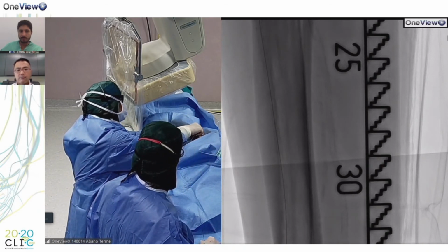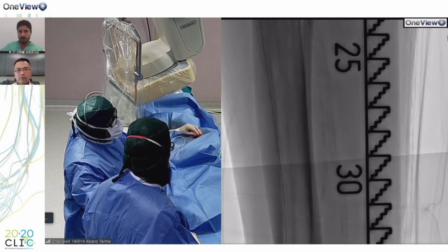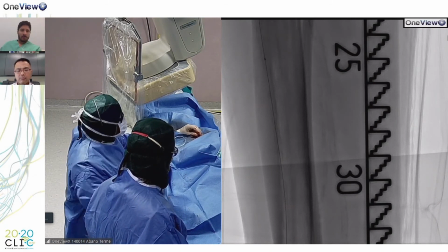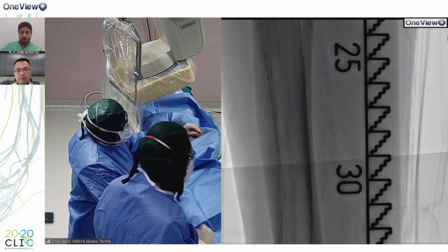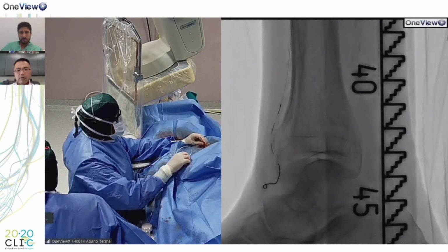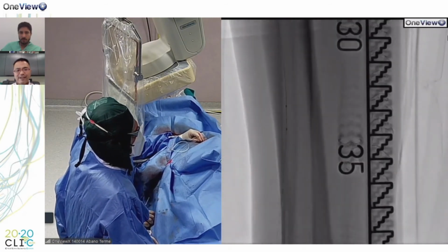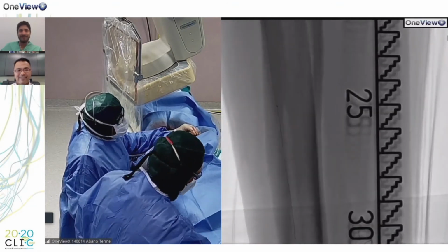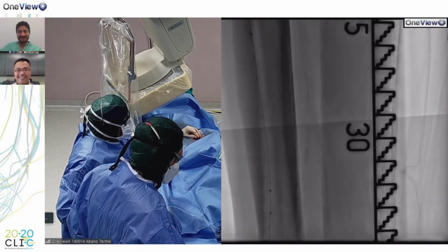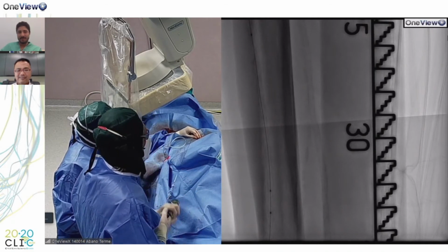If you suspect that it's an open plaque, so with no cap, and so we could have the possibility to have an embolization, probably your strategy has to be followed. So I must say, looking at the angiogram, it looked okay, but after the IVUS, it looked a bit worrying. Yes, the IVUS imaging was impressive. The plaque is really more complex than I could imagine.